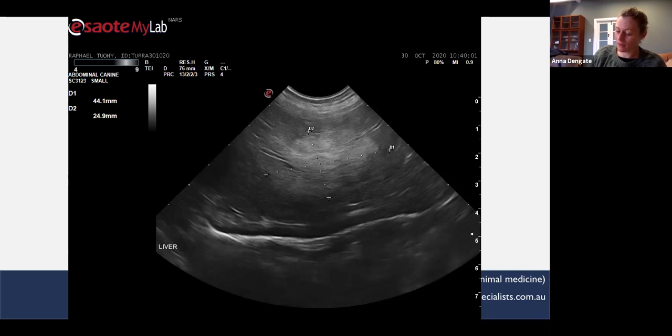The other one that I will put on my list is hepatocellular carcinoma and hepatoma, which are both tumours that tend to be hyperechoic. Most of the differentials we've talked about will be diagnosed on fine needle aspirate, or at least we'll be able to say low grade, high grade, and know whether we need more information about it. So in a lesion like this in the liver, I usually recommend aspiration and cytology.